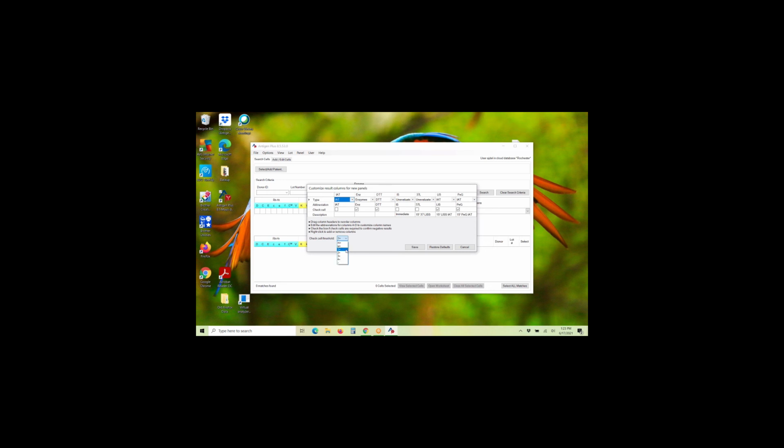But I've also worked in a couple labs that did use the 1 through 3+. I don't think I've ever seen a 4+. That would be, not mixed field, usually. Okay, I guess you can't see mixed field 4+ from time to time. Okay, so that's that part of it.